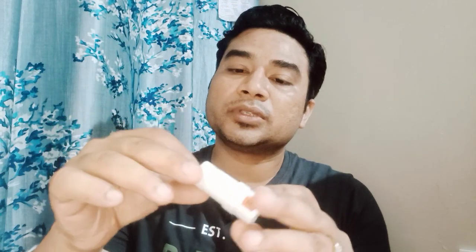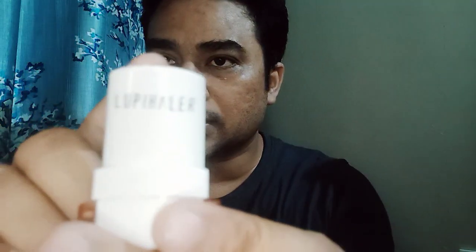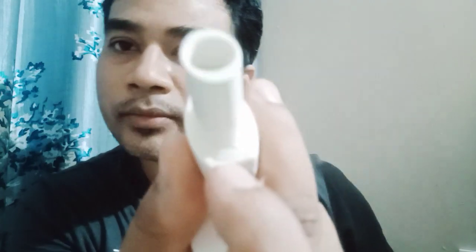Now coming to this device, this is a cap. This is a Lupihaler. Now you can open this. You can see this device is like this, and I'll show you. See, this has an arrow mark down here. Now it's visible. This is an arrow mark here.